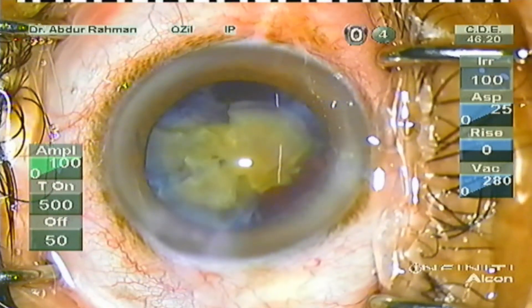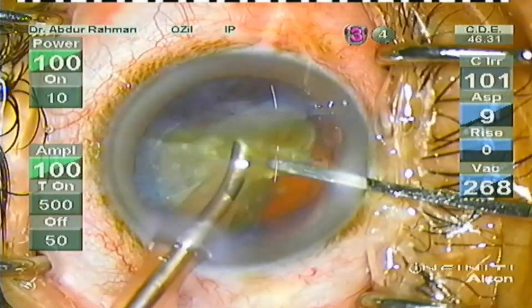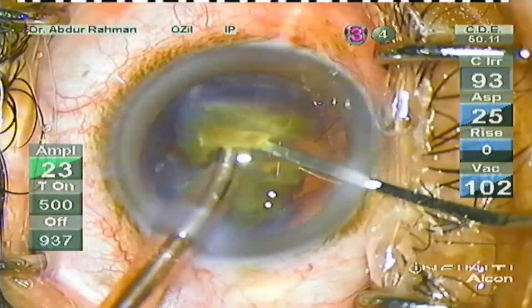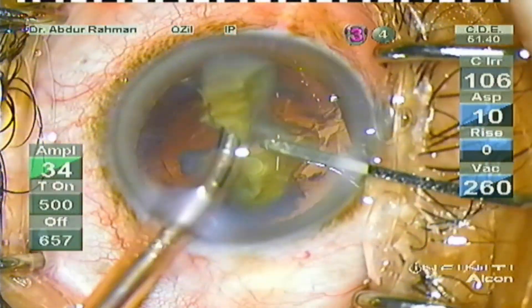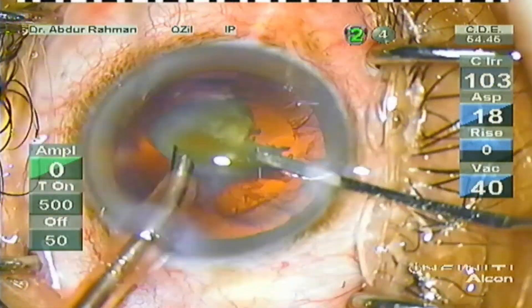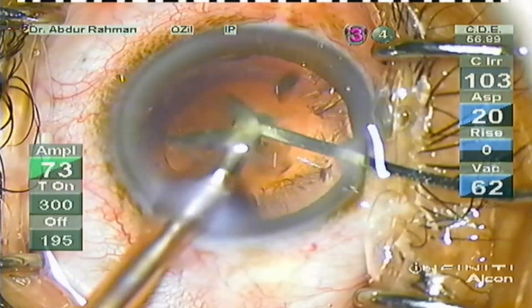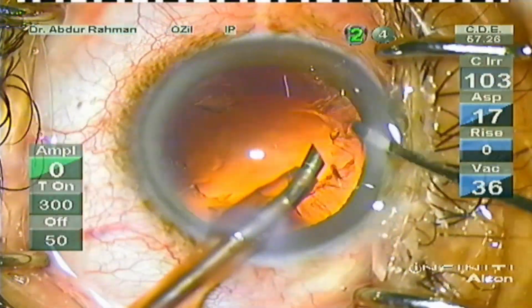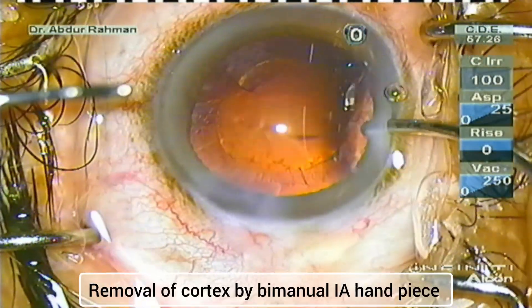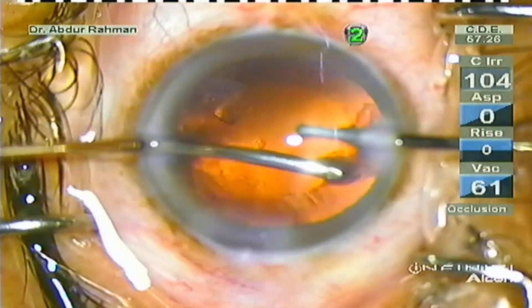Now when one half of the nucleus has been removed, I refill the anterior chamber with OVD. This will again protect the endothelium from further cell loss by the phaco energy. Again shield the endothelium with the spatula. Now you have to protect the posterior capsule, so place the phaco piece above and the spatula below the nuclear piece while emulsifying. Thereby you can protect the posterior capsule from any posterior capsule tear.